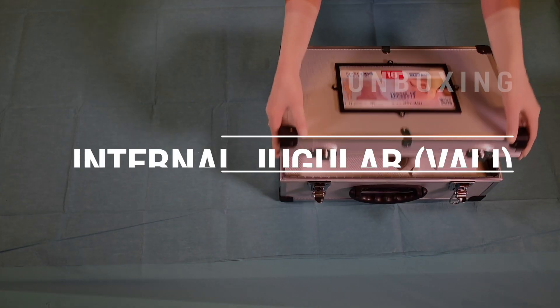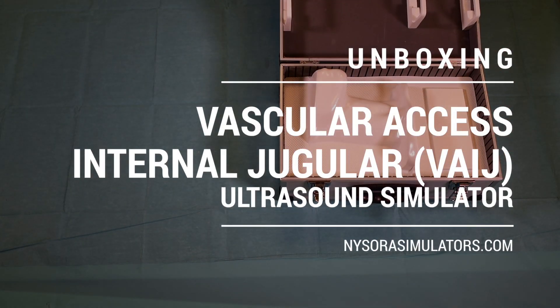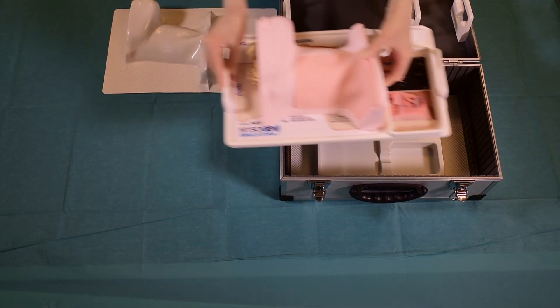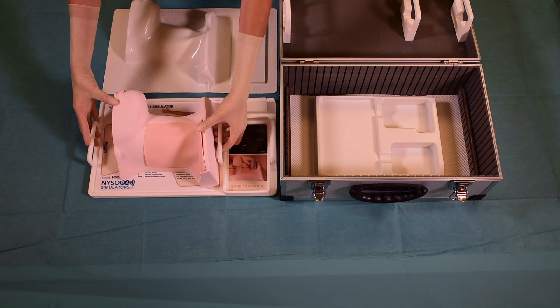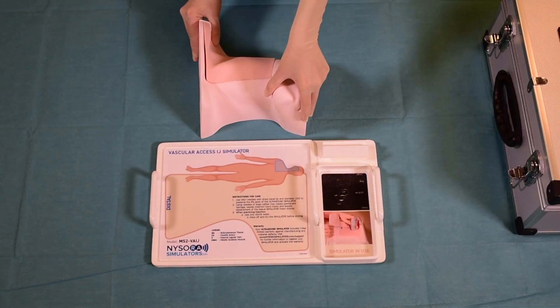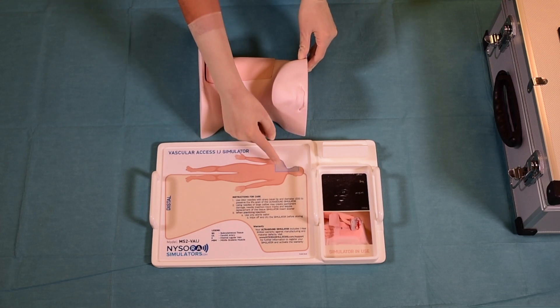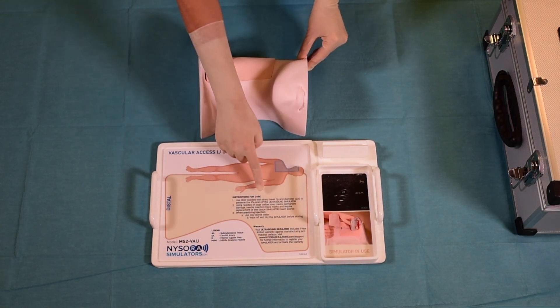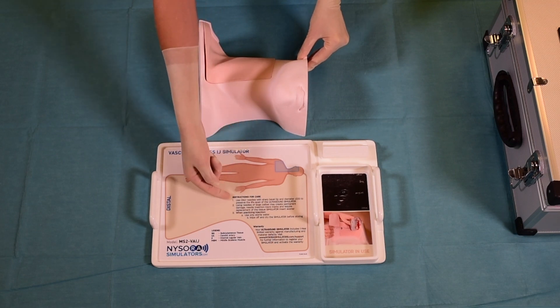Like all other Nysora simulators, the vascular access or internal jugular vein access simulator comes in a custom design box, which is convenient for carrying and storage. On the custom tray there are clear labels as to which part of the body the simulator belongs to. Clear instructions for use are also provided.